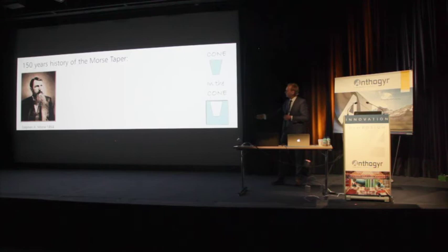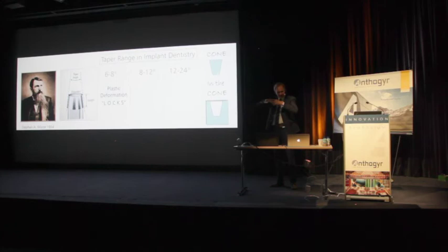It was invented, the principle of the cone in the cone, by Morse, and the real Morse taper has a taper angle of only 6 degrees. This is very unpractical in implantology because the plastic deformation of the two parts moving into each other creates a lock, and it's hard to take them apart. So that's not practical. We have a good seal. If we go too wide, let's say 24 degrees, we have no seal. The best compromise is the 12 degree.